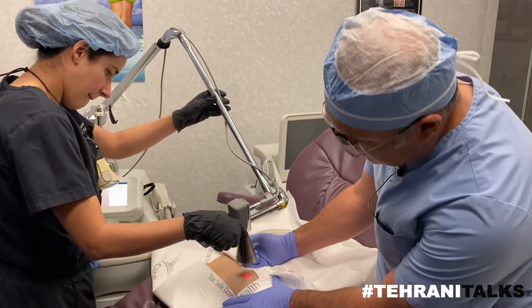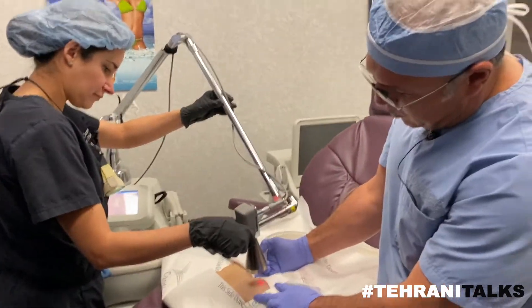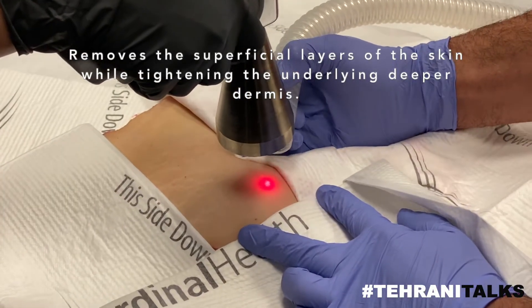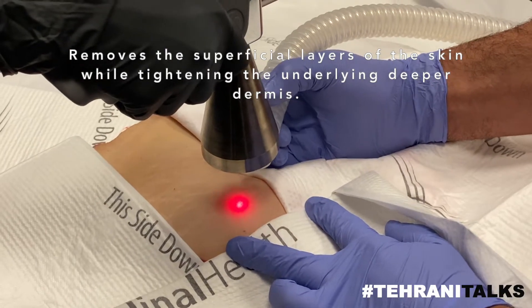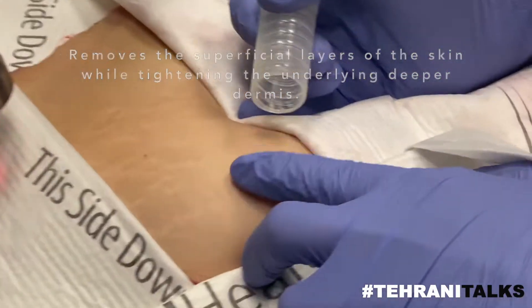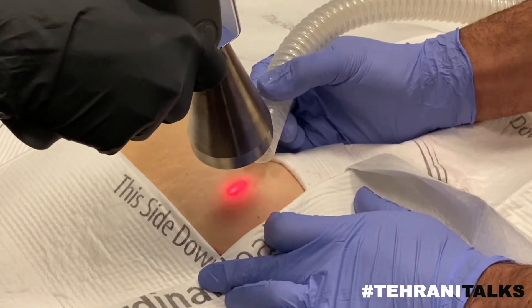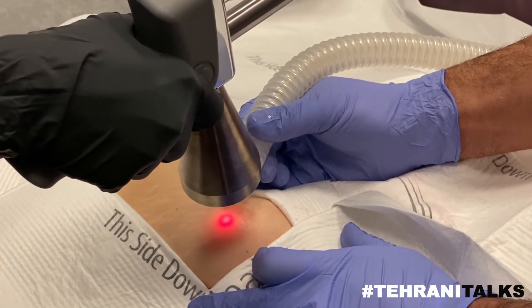This is a specimen, so it's not a human. We're doing a test to see how it's working. What it does is it goes through the skin in a very sequential manner and delivers energy and takes a layer of the skin off. So it's a true resurfacing peel for patients that need a very deep peel.